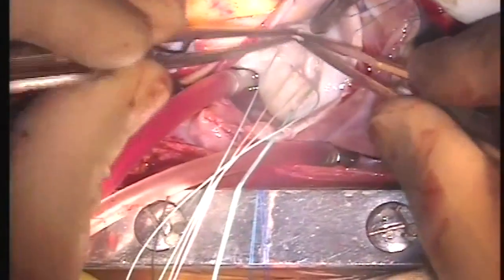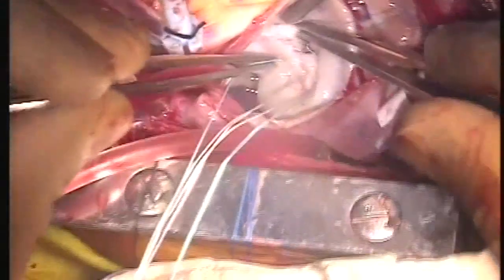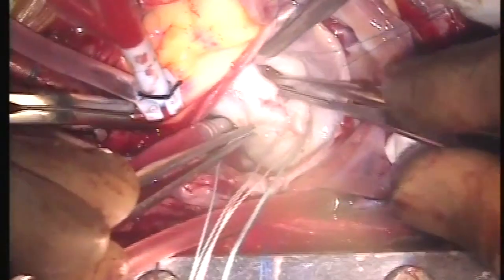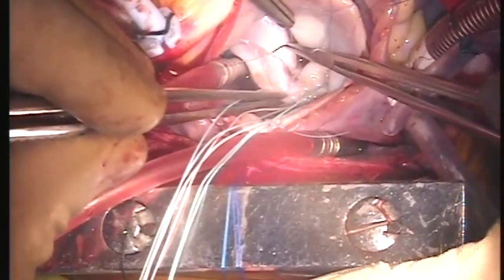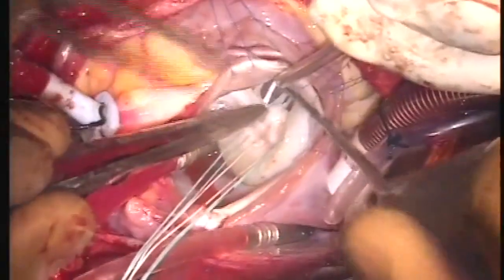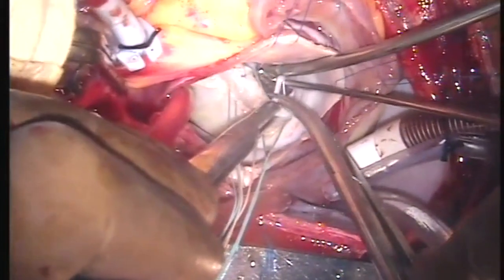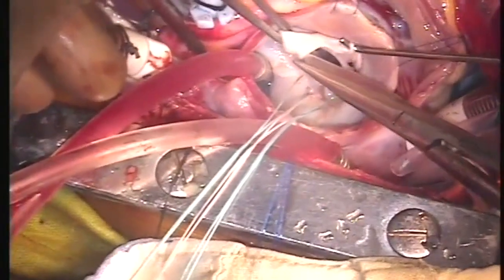So these holes are closed primarily with 6-0 Prolene sutures. So this is the first hole which is closed and this is the second hole which is closed with the Prolene. The secondary chordae which are restricting are released so that the restriction is released.